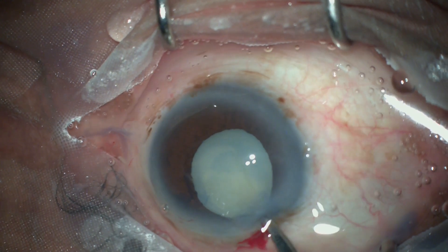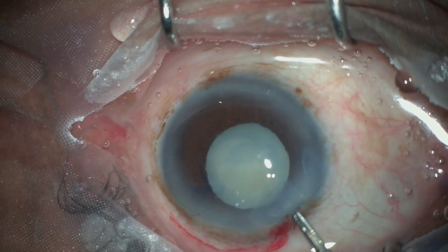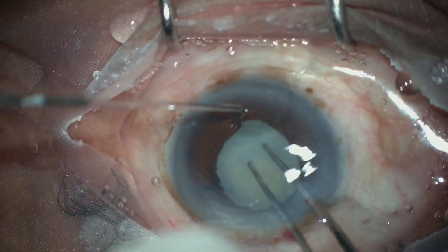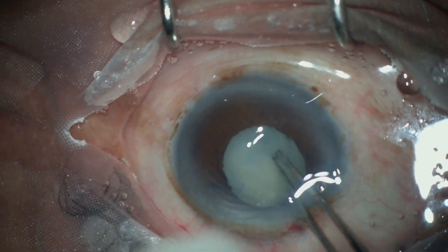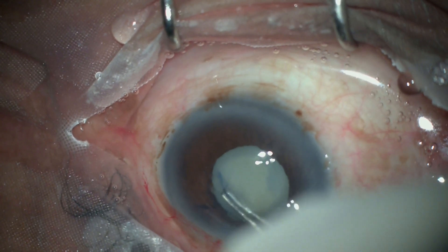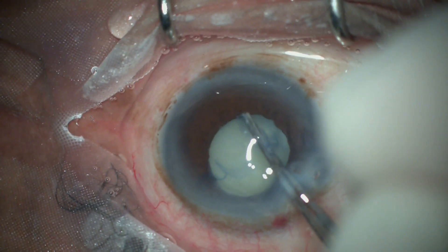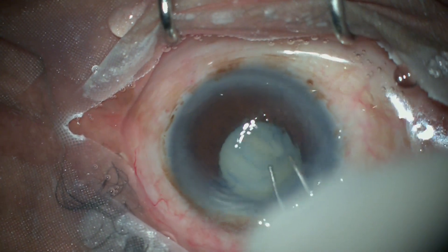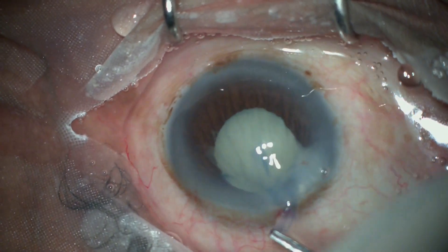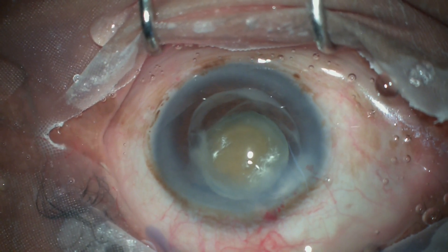The better approach is to use Vannas scissors: recognize the initial nick and make a prominent cut in the capsule. Once the cut is made, recognize the flap, hold it, and try to tear it. Fortunately, despite all these challenges, the capsulorhexis was performed satisfactorily, and I was even able to spiral it out where it was apparently small. These capsules are loose and at times calcified, but the rhexis was completed successfully.